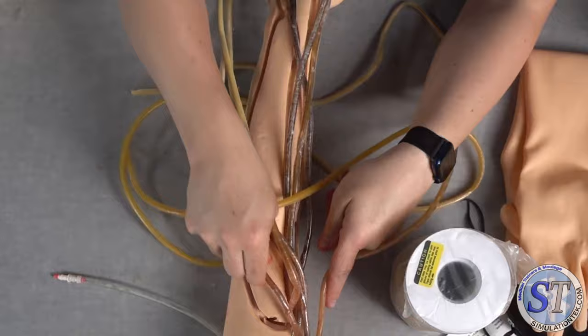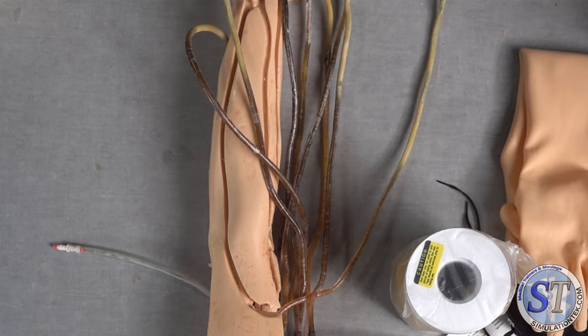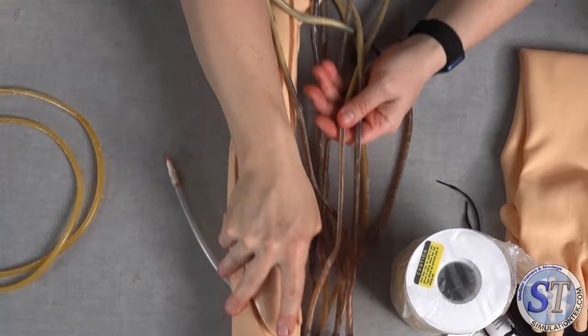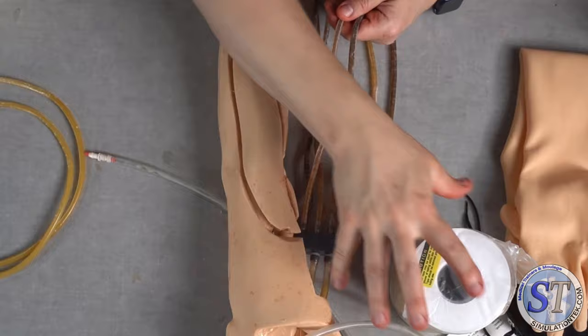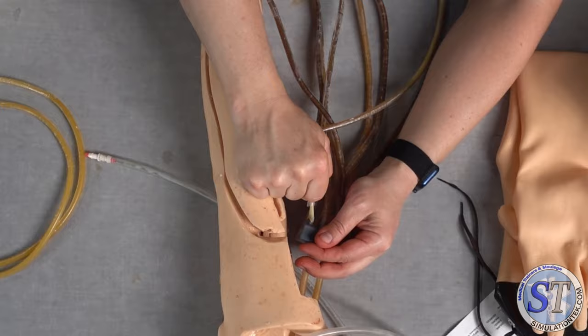All right, so what we're going to do here is start investigating how to make this all work. First thing I'm going to do is get this tubing that I have here that's not enough of it out of the way. This first one comes in here, out there. I'm going to take off one edge and open up my tubing here. Don't lose that. Then I'm going to measure off what my tube size is.